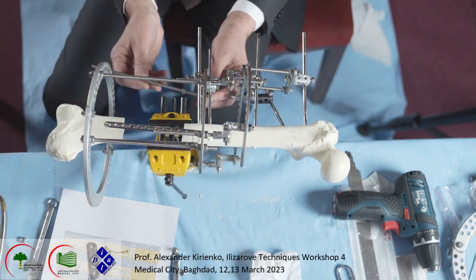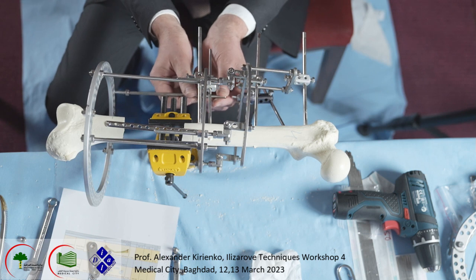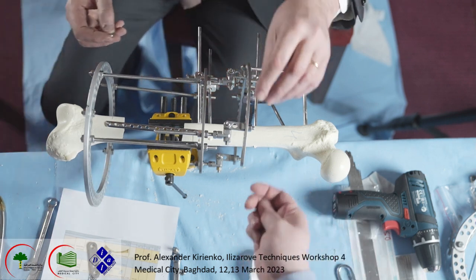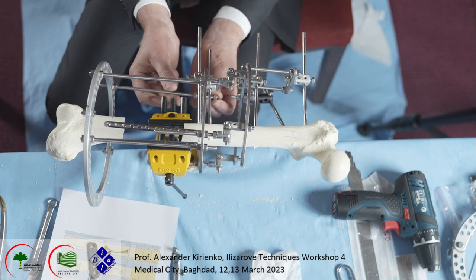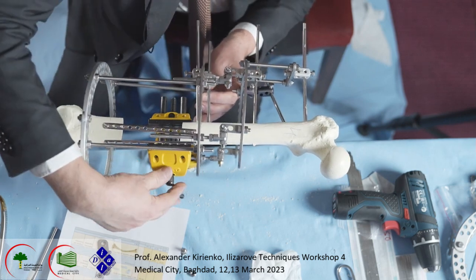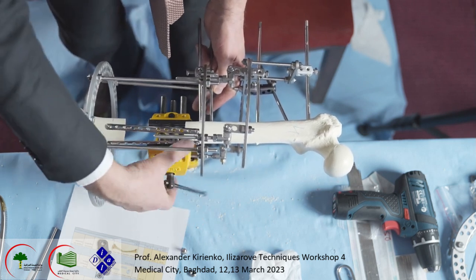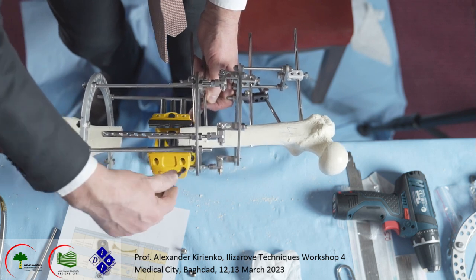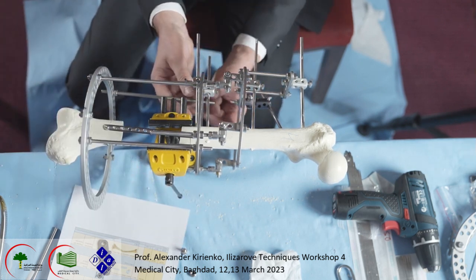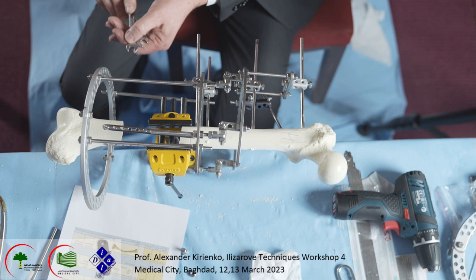I show you this. I put now another rod. Okay, now we have 3 rods.